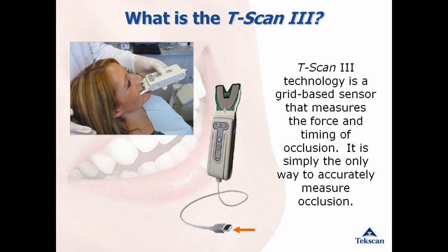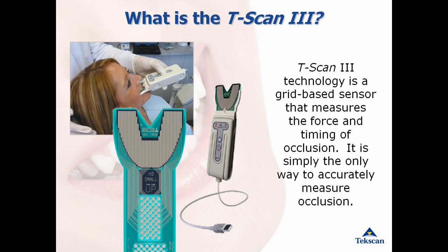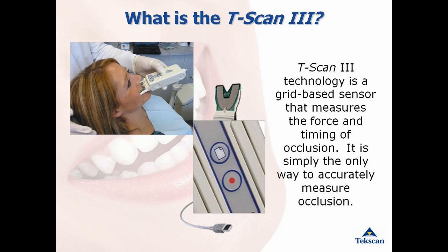The handle connects into the USB port of your PC and is easy to move from one operatory to another. The sensor, designed to fit the shape of the dental arch, inserts into the sensor handle. The T-Scan handle has two buttons that will function on the panel here. The first button brings up a new recording window, and the second red dot button will start and stop the recording mode.